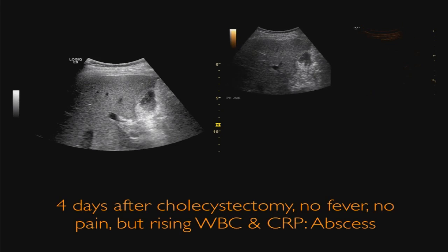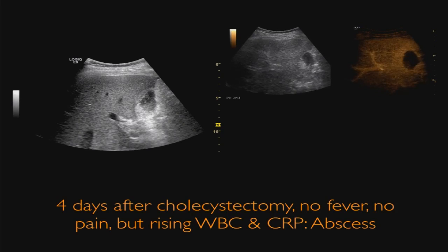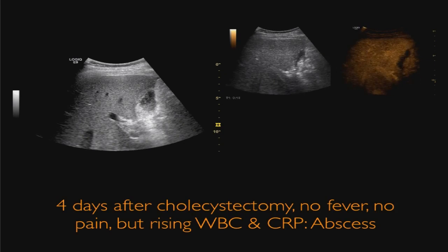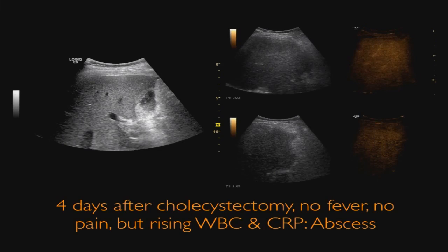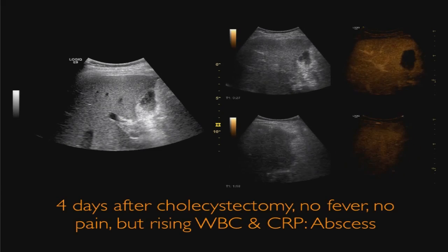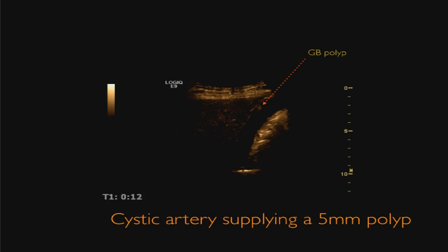So this is why he was introduced to us. And what you can see here is an abscess. You can see the reactive hepatitis around this abscess. So that was the indication for puncture. So we punctured this patient immediately, and that was pus that we got. So we then put a drainage in. So that was the consequence. So we can detect that at a very early stage, and that means also that the patient can be dismissed earlier from hospital.